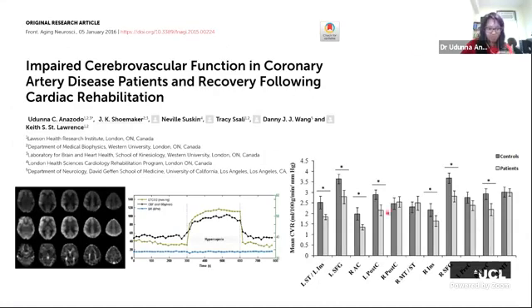And lastly, in terms of being able to provide this multi-parametric information, we've shown that ASL can be used to measure vascular tone. So looking at vascular activity, essentially change in vascular tone from, say, baseline to when an agent is given that will cause the blood to vasodilate. In this case, we used carbon dioxide, which essentially just causes global vasodilation.